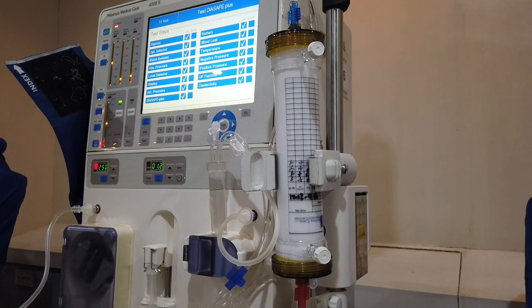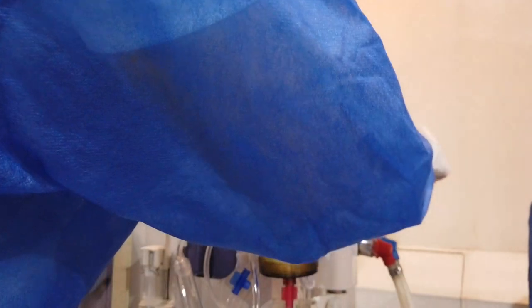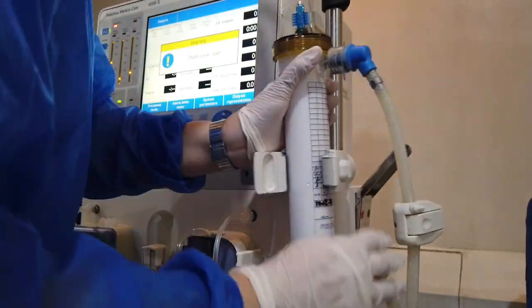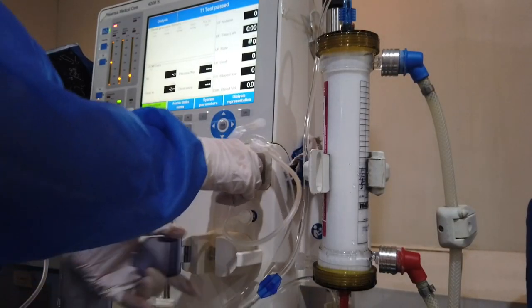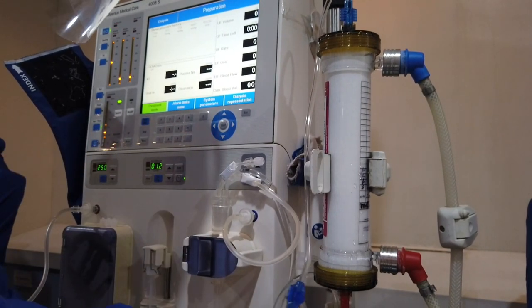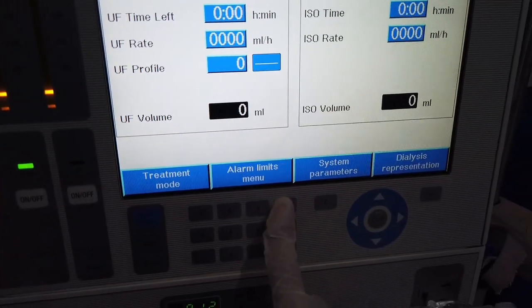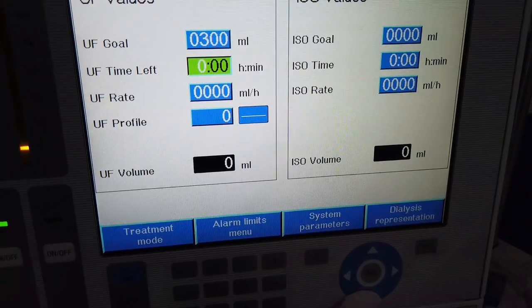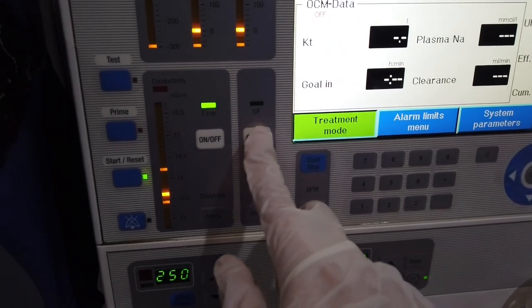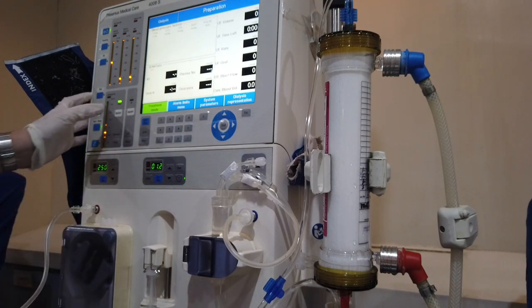Once T1 testing is complete, next step is connecting coupling to the dialyzer. Open the coupling shunt and connect the coupling to the dialyzer. Blue to blue, red to red. Properly place the venous chamber inside the air bubble sensor and thread the line into the occlusion sensor below it. Set UF for 300 ml in 6 minutes for UF rinsing or recirculation. Then turn the UF on. Once done, machine is ready to be hooked to patient.